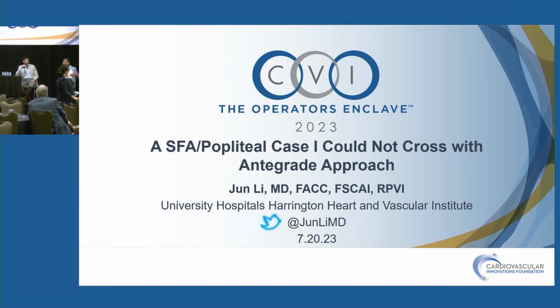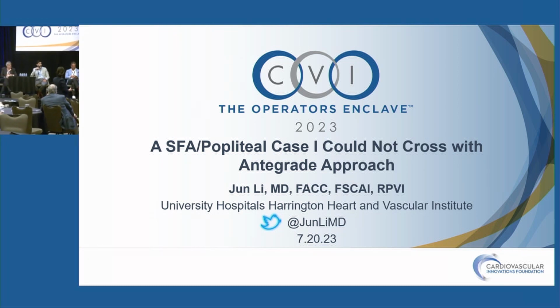Dr. Shamas? Always prep the foot, and CTA if there's bad femoral waveforms or pulse. CTA and prep the foot when I expect trouble beforehand, because you can probably tell from the anatomy this is going to be a complex case. You start getting ready for it. Yeah, I agree. Prep the foot if you think you're going to run into issues.